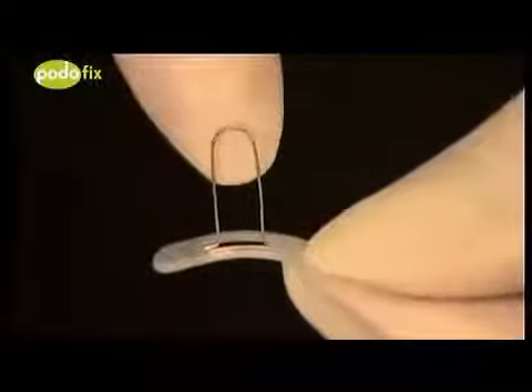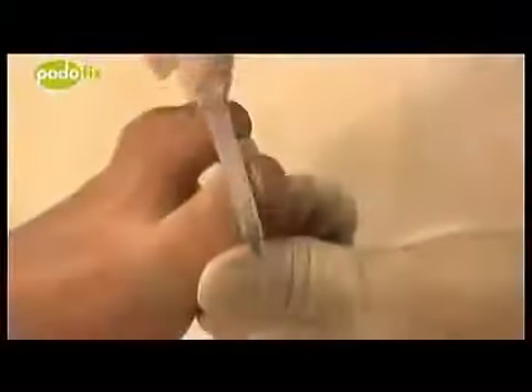The Podofix adhesive brace helps to quickly and effectively correct ingrown, rolled-in, and deformed nails. Cosmetic corrections and preventive treatments are also possible. It also serves as a suitable prevention method after successful treatment with a wire brace.